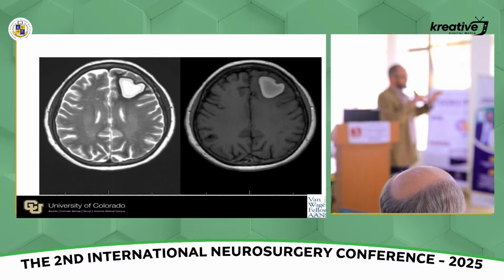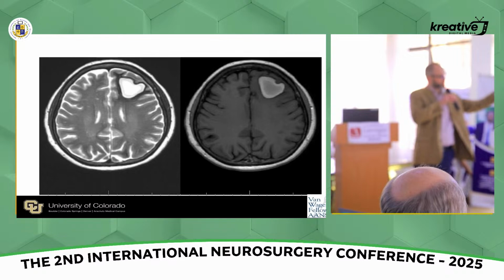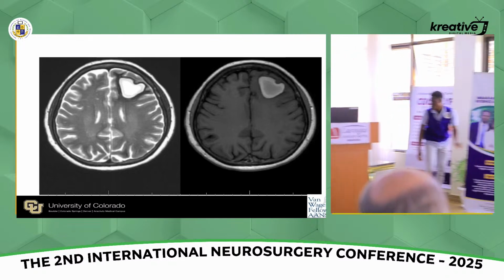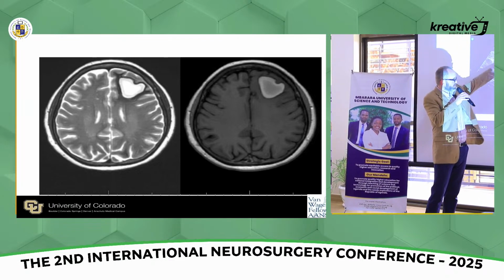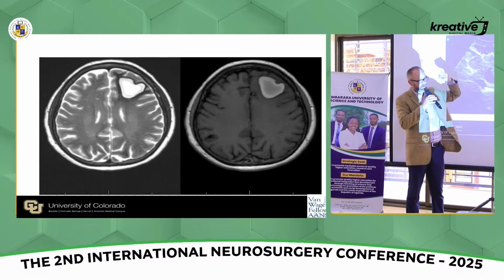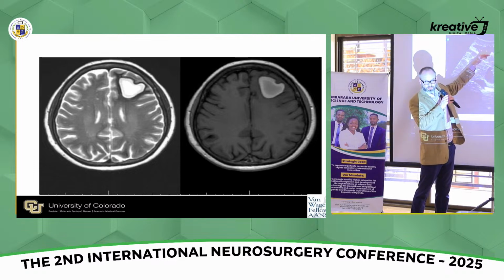But here is post-resection now. This is now flipped the other direction, but you can again appreciate that the compressed lateral ventricle has now been nicely decompressed by resection of the tumor. And this is one of the artifacts that we'll get into, but if you image through fluid, the back wall, because you have less attenuation through the fluid, is going to reflect brighter than it will over here.